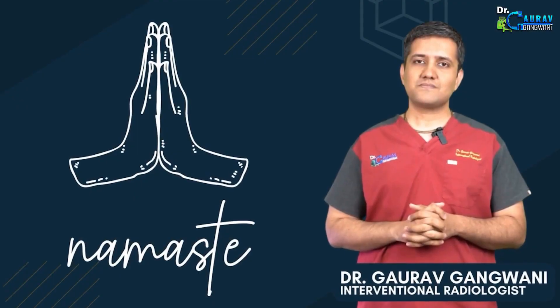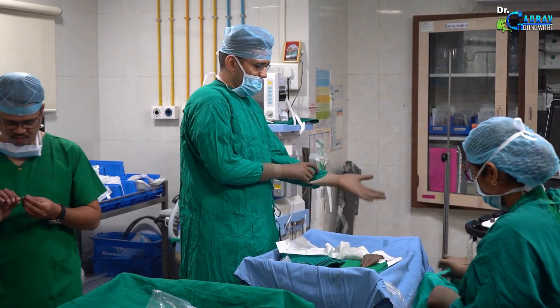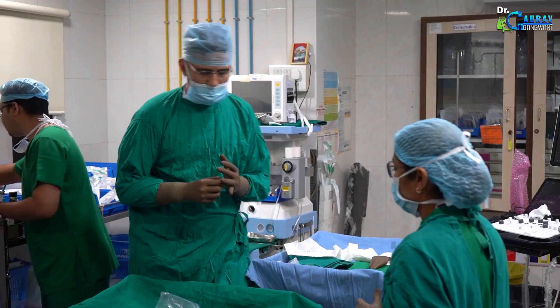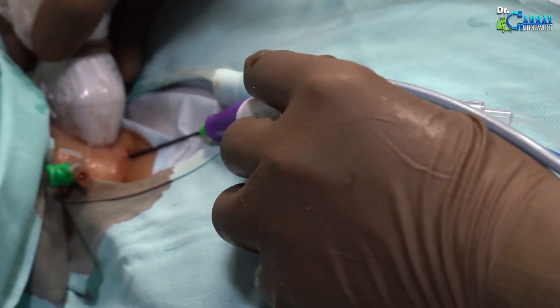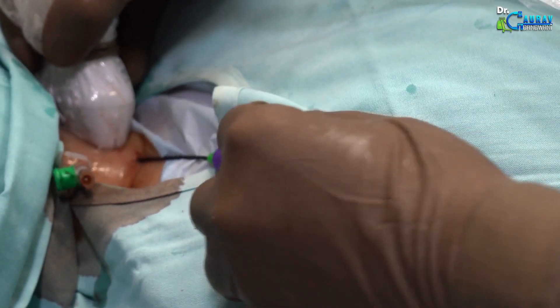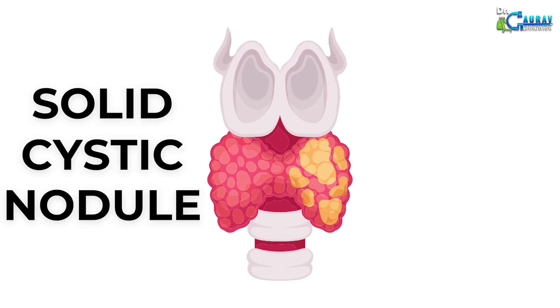Hello friends, we bring you another live demo from Bhaktivedanta Hospital, Meera Road. Of course, this is a recorded demo, but it was live at the time we shot it — showing how we can completely destroy a thyroid nodule with a small needle without any surgery. This nodule is a bit different because it contains a lot of fluid, meaning it is a solid cystic nodule.